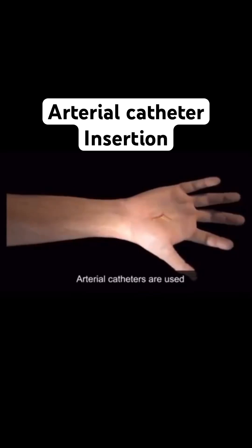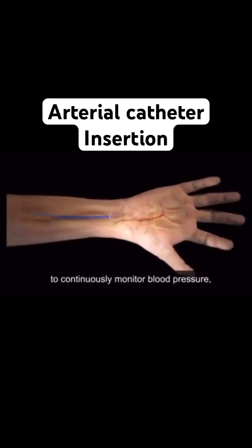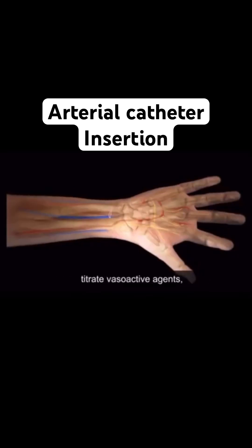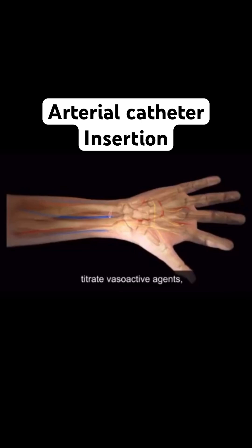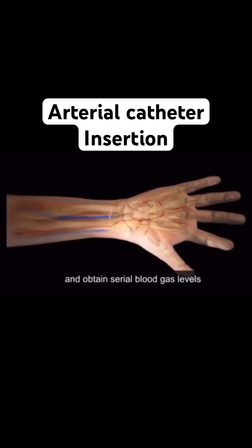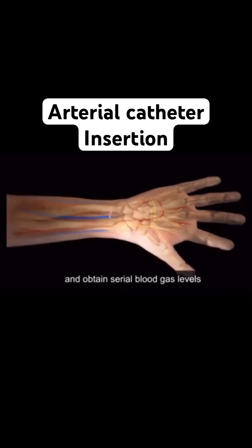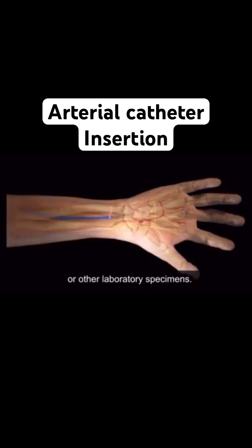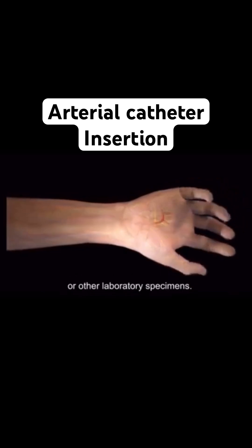Arterial catheters are used to continuously monitor blood pressure, titrate vasoactive agents, and obtain serial blood gas levels or other laboratory specimens.